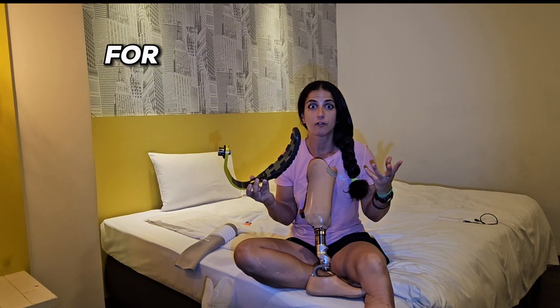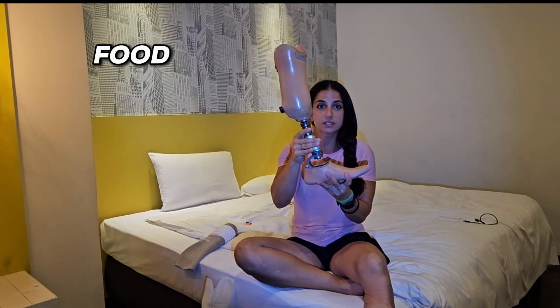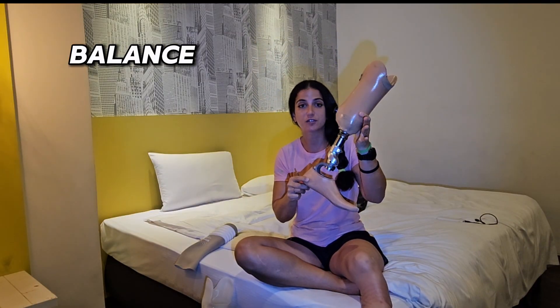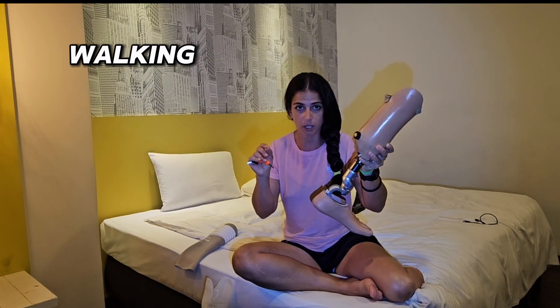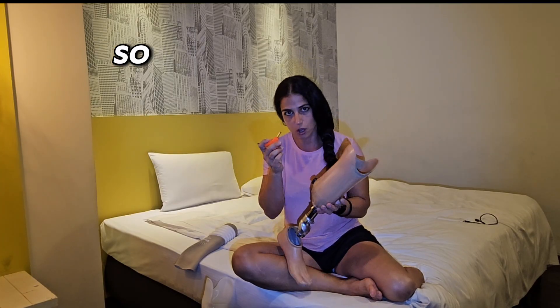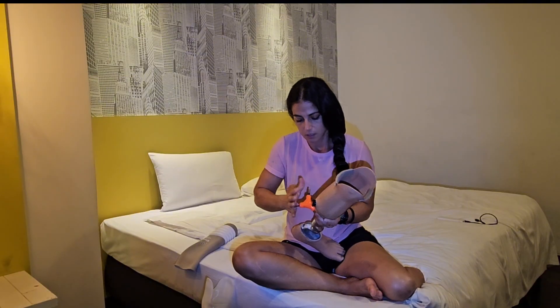If you gain weight in the future, be careful because the foot might not be suitable for you anymore. This other foot is the balance foot — it's a regular, simple, lighter foot for walking.